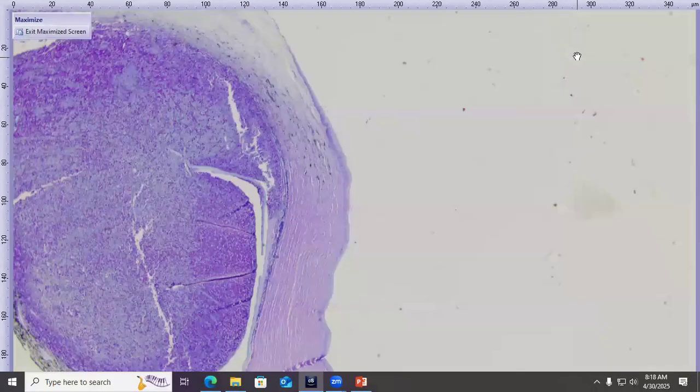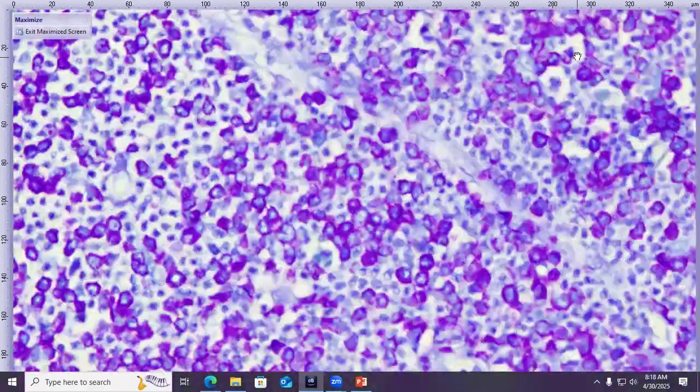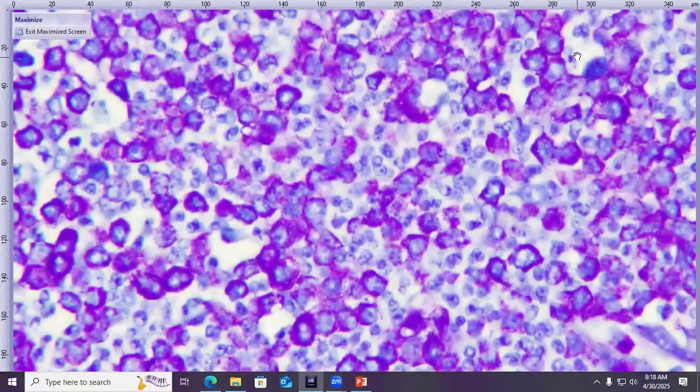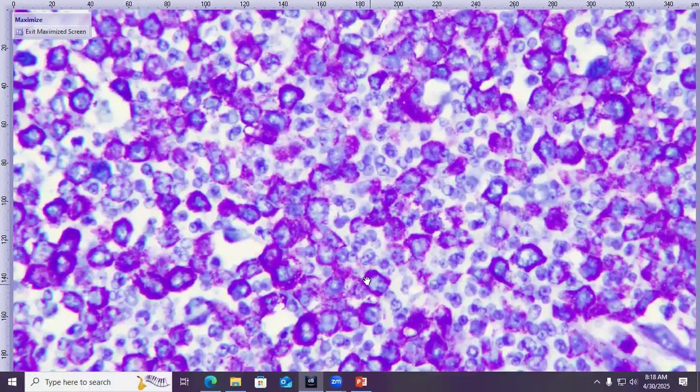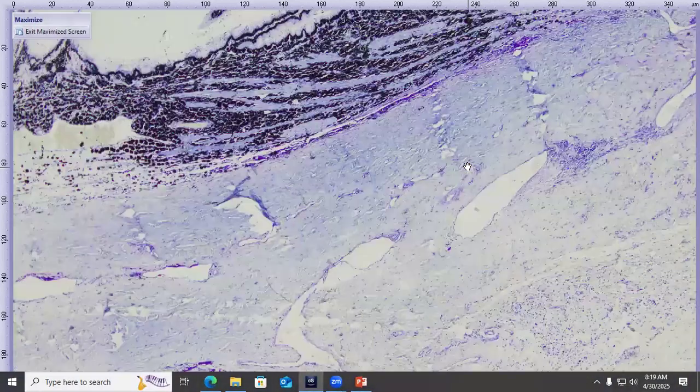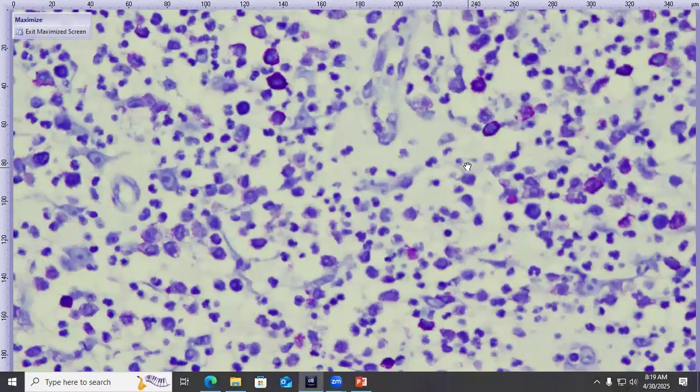Okay, so we have the intraocular and periocular mass, which we already strongly suspect is a mast cell tumor. I did toluidine blue too, which is quite gorgeous. Here it is. And so toluidine blue is going to highlight the metachromatic granules within mast cells. So all of these really brightly purple granules are the granules that we see in mast cells. So this confirms that this is an intraocular mast cell tumor, as well as, somewhere, there we go, an episcleral mast cell tumor. Here it is.